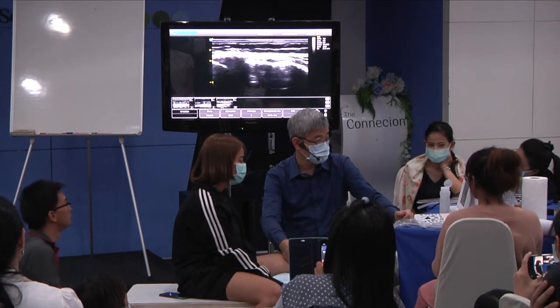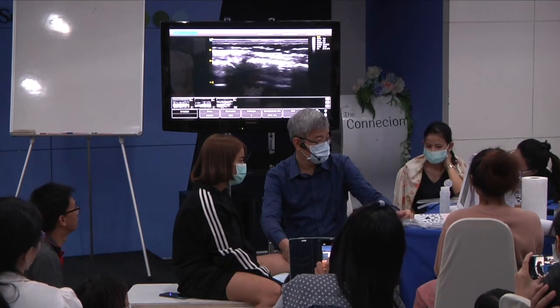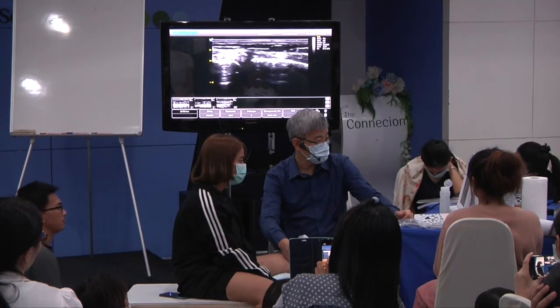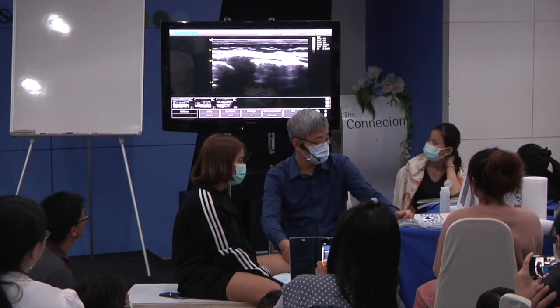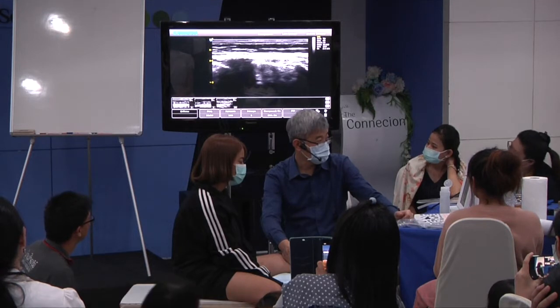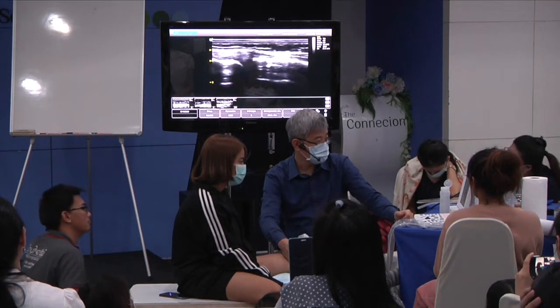Now the brightness is pes anserinus. Medial collateral ligament. Dark, right? Pes anserinus.